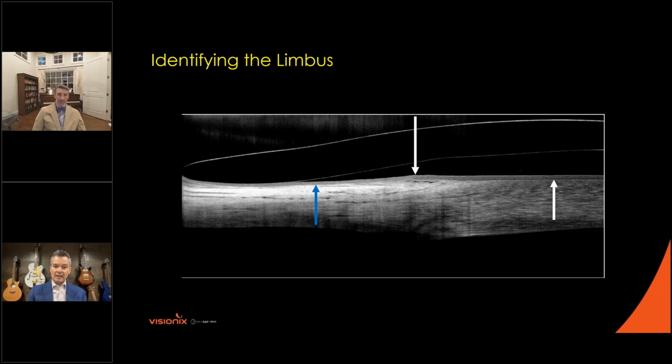But there's another anatomical marker, and I'm going to draw it in here. It's this small little angle of tissue that comes from the sclera into the cornea. And I'm going to take it away here just for a second, and then I'm going to reintroduce that. This really gives us guidance on where to look initially so that we can start doing a deeper dive and identifying the limbal region. And what we've just identified right there is where that limbal region is.